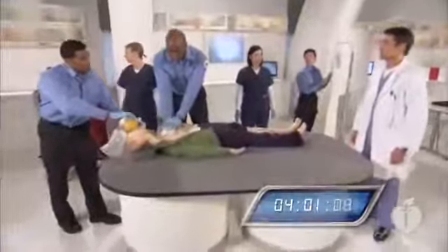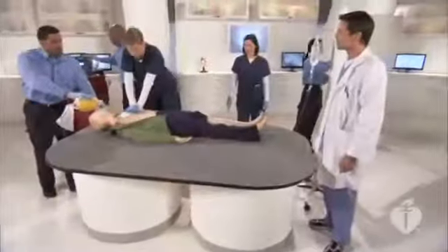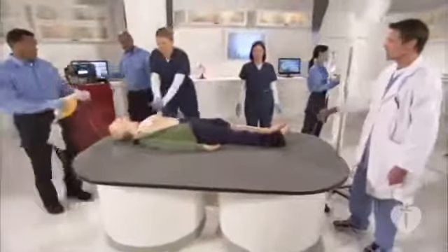2 minutes. Okay, let's analyze. Switch roles. Okay, the patient is in persistent VF. Let's shock again at 360 joules. Charging at 360 joules. Shock ready, clear the patient. Shocking on 3. 1, 2, 3, shocking. Shock delivered. Continue CPR. Continuing CPR.